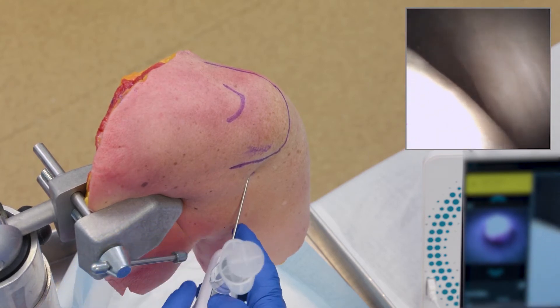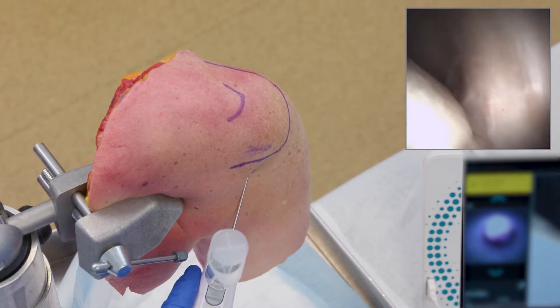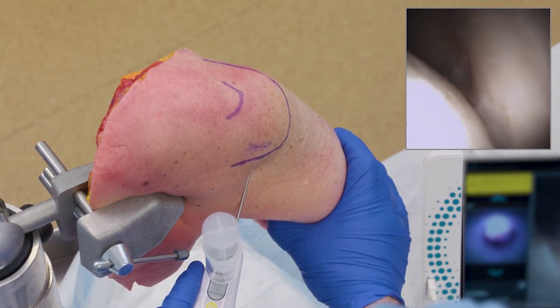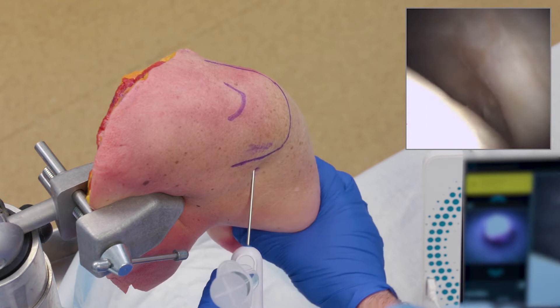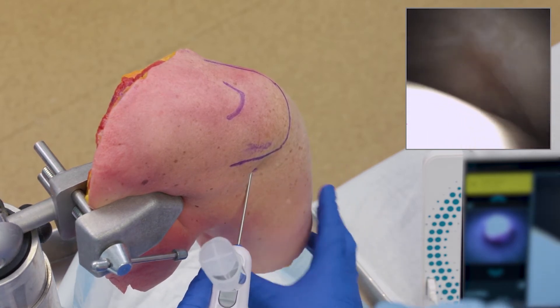What this does allow me to do is have a dynamic evaluation. I'll put a chuck around the arm so I can grab it and abduct it out to the side 45 degrees and see that insertion of my rotator cuff on my humeral head, or I can dynamically internally and externally rotate the shoulder as well to evaluate my rotator cuff as it comes across.